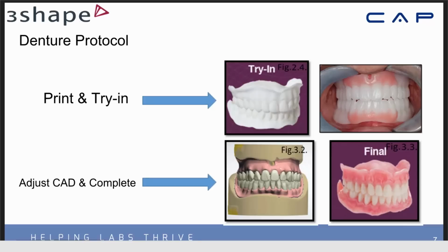Now, one thing that may be slightly not as good with this is the dentist doesn't have the ability to move the teeth. He could certainly grind on them and shorten them, or he could add composite to them and lengthen them to give us some idea of changes necessary. And I think this workaround is satisfactory. I don't think it creates any significant problems for us.